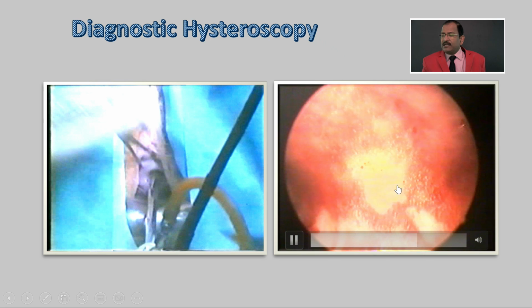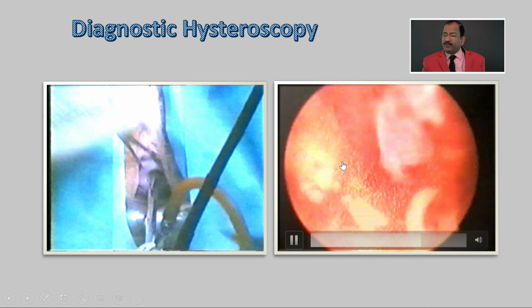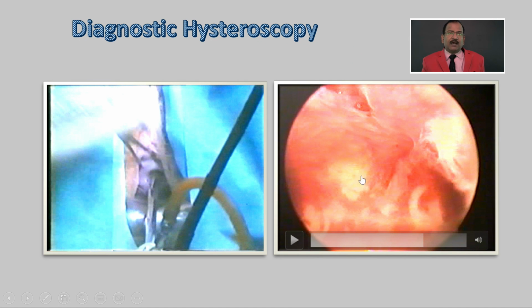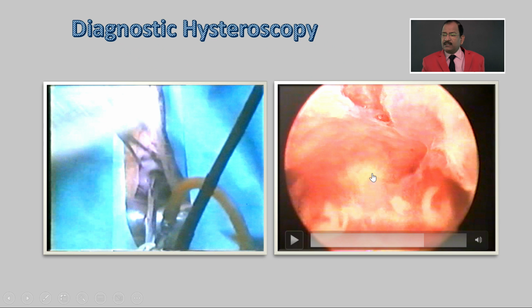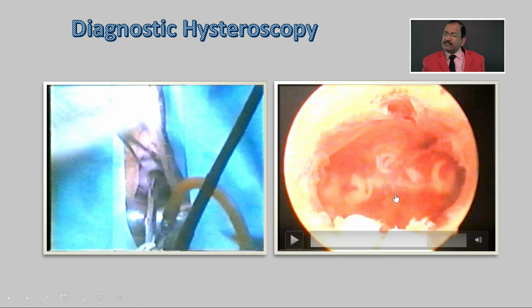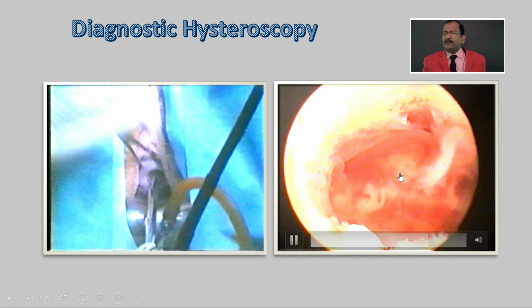And this is the fundus. You can see this uterus is a little arcuate, a little arcuate uterus. This is the fundus, and this is an arcuate uterus. This is texture. Brighter means nearer. This is the internal os, and this was a normal uterus. This is a normal variation. Arcuate is not always pathological. This is the internal os, and then you come out.